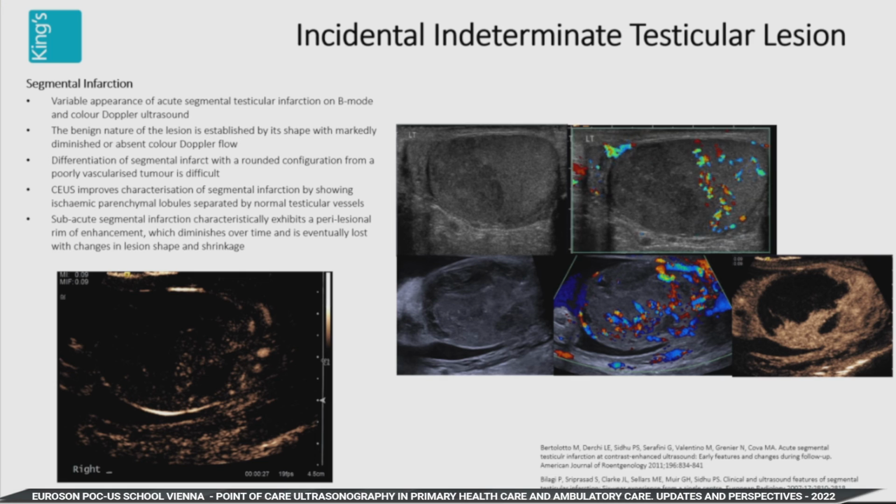But you can use your multiparametric imaging in those benign lesions very clearly, because if there is no vascularity, your contrast will tell you there's no vascularity.